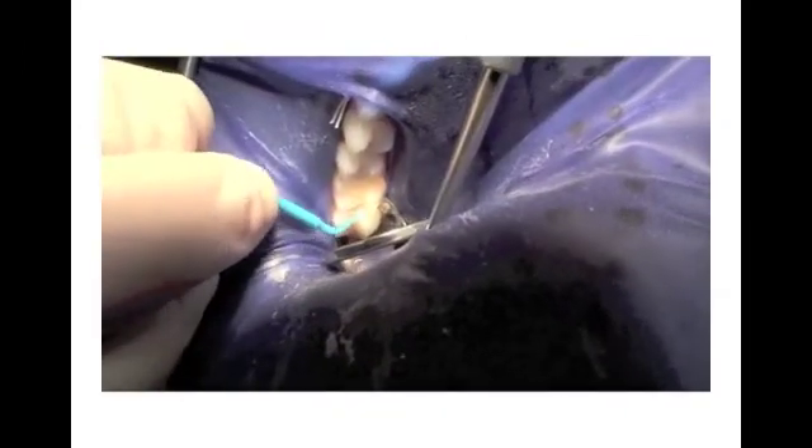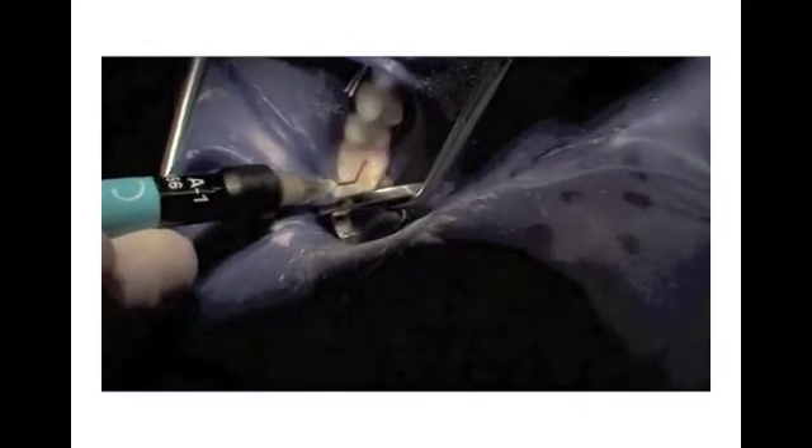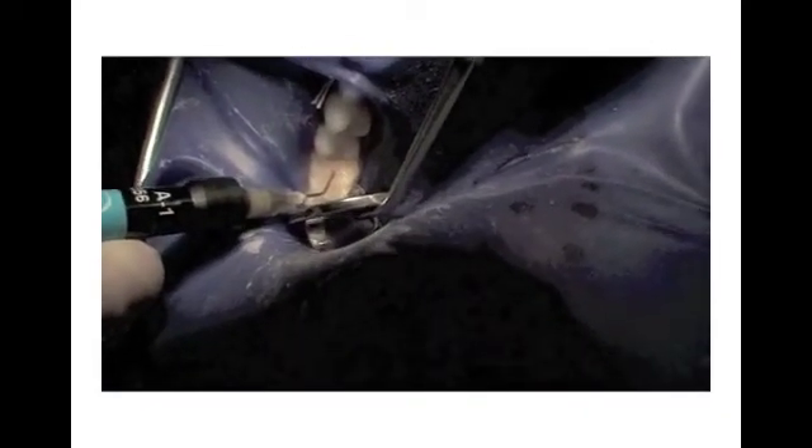Restore the tooth with your standard resin technique and procedures. In this case, Dr. Schaefer is applying Prelude, a self-etched primer and adhesive, and then restoring the tooth with a flowable composite. The three main advantages of minimally invasive dentistry utilizing the PrepStart H2O unit are small conservative aesthetic restorations of cavitated lesions, and for most patients, no local anesthesia is needed.